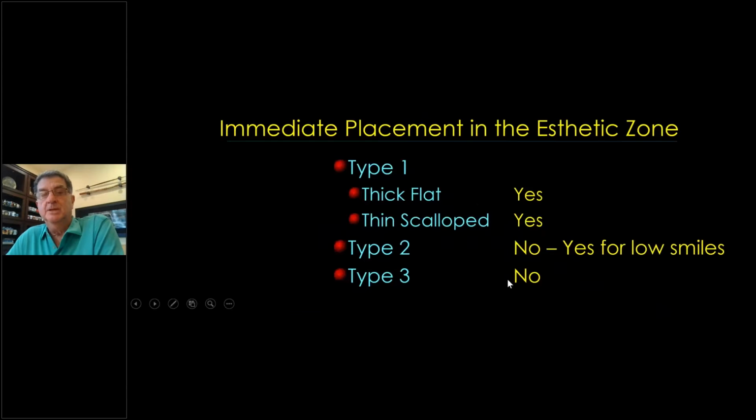So to summate this, immediate implant in the aesthetic zone, type 1, we do it. Whether it be thick, flat, or thin scalloped, yes, yes, yes. If the buccal plate is there in a type 1 defect, which is what it is, we do immediates almost all of the time with fewest exception. Type 2, we don't do it in the highest smile lines, which thank goodness is only about 20% of our cases that show the buccal tissue. Yes, for low smile lines. And for type 3, no immediates, let it heal, then come back and do a healed ridge, except for rare circumstances like I showed you with low smile lines.